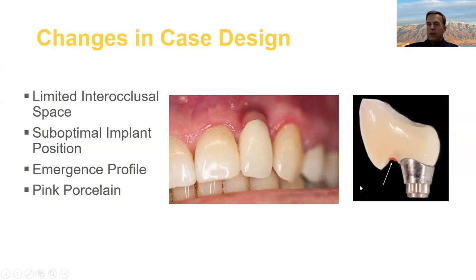Sometimes you'll see this too in contact areas where you have a large crown, let's say a lower molar with a 4mm implant under it. You might have to have ridge laps right at the crest of the ridge so you don't have big dark triangles that get food stuck in them and things like that.